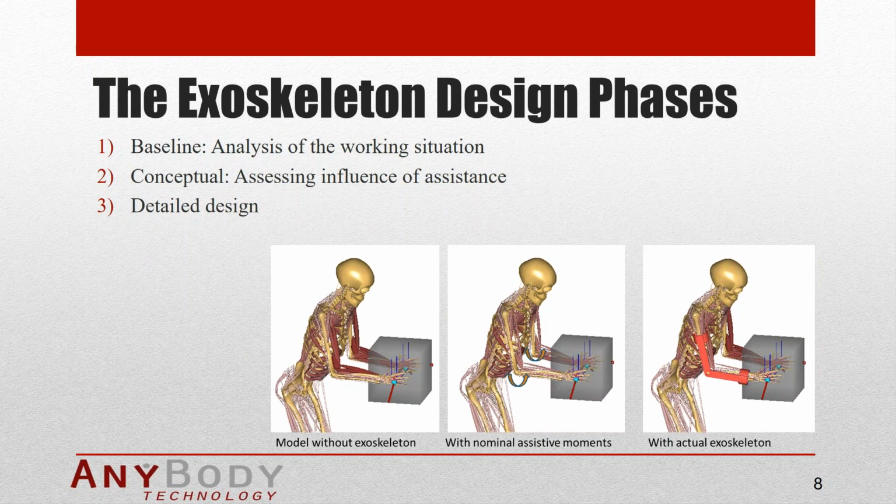This is very important for a number of reasons. First of all, to know what the exoskeleton is actually going to do, and more precisely what parts of the body and what situations it's going to work in. But also, and that's what the name baseline indicates, you need something to allow you to compare the situation before and after the exoskeleton, so that you can see the possible benefit that the exoskeleton is making, and also so that you can see possible problems that the exoskeleton might be causing. I will get back to that in more detail a little bit later.